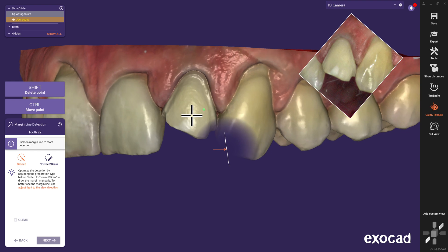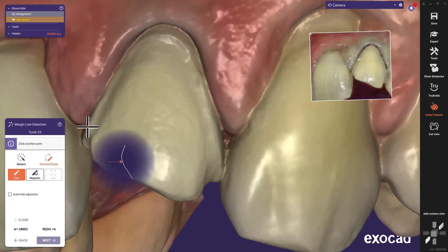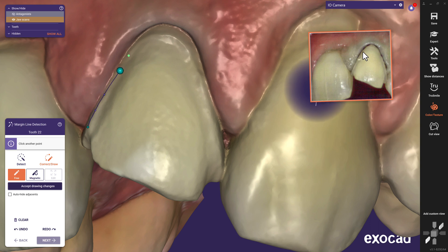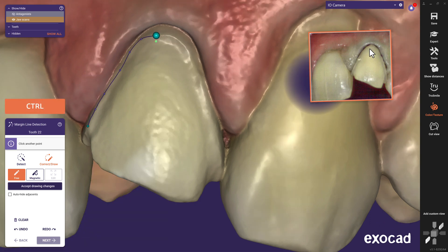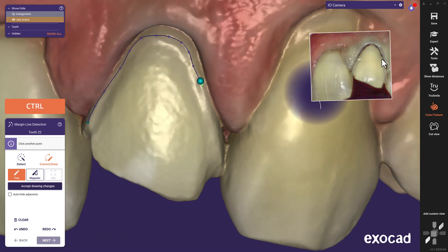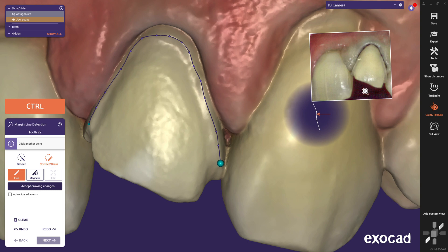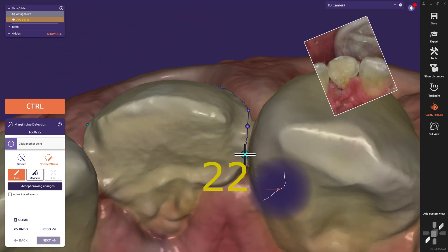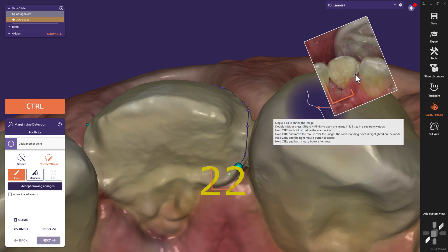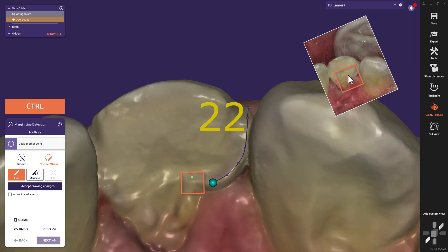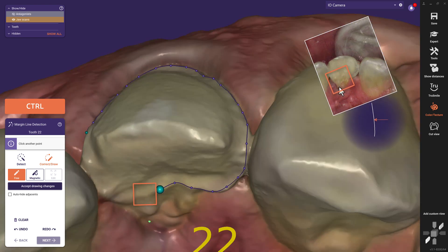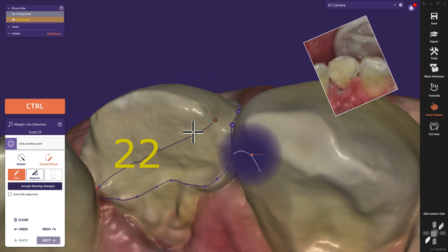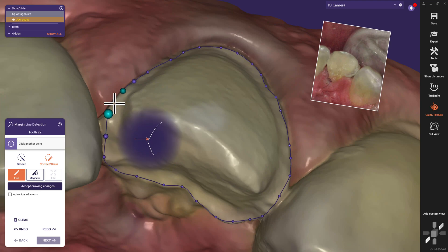Margin line tracing. Now you can draw the margin line points directly on the 2D image. Hold the CTRL key and click with the left mouse button to add points to the margin line. Additionally, a green point displayed on the 3D model indicates your exact position corresponding to your cursor on the picture. With CTRL and a right click, you can rotate the view. And a double click will close the selection.